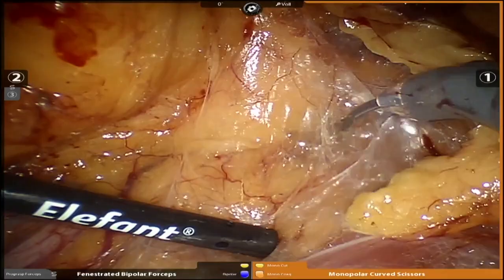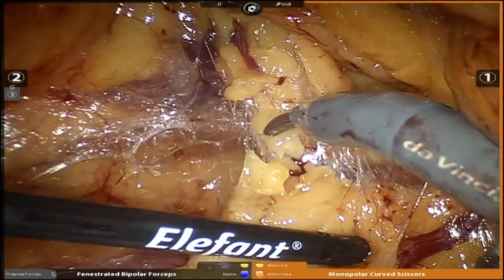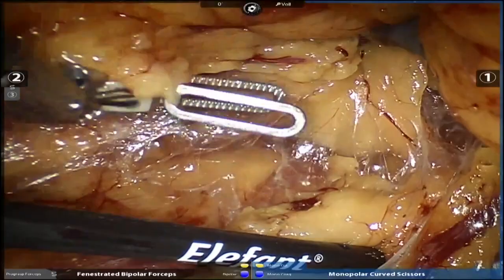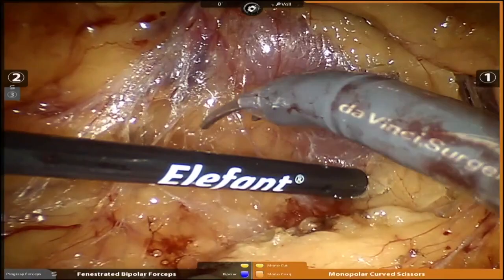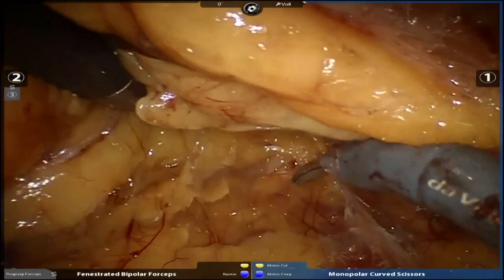So the Xi is very nice, but I did most of my retroperitoneal partials early on. We started actually with a standard system. Actually, before the da Vinci Si was available, we were able to do the retroperitoneal approach with a standard. So you don't need the Xi, but it's much nicer. But you can create this space. And with getting the arms in the proper position, you can do this operation with pretty much any robot. But the Xi clearly has advantages.